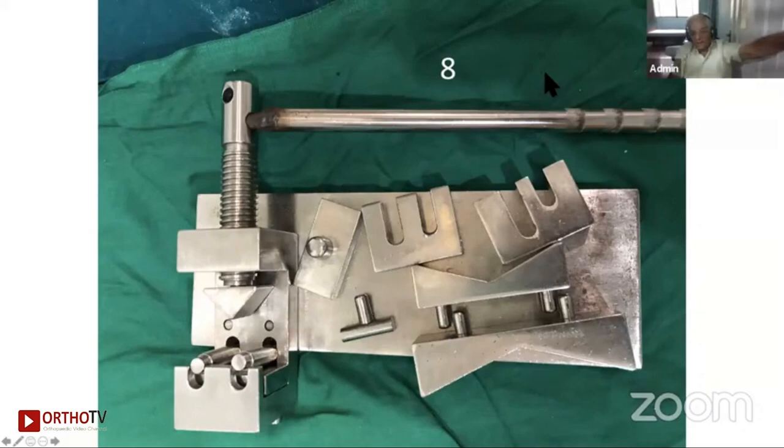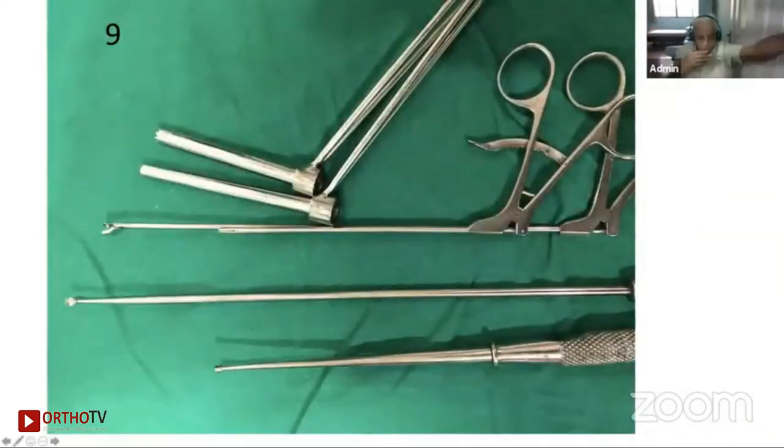Yes. Now here is this instrument set. I purchased it from one of the instrument companies, for the abdomen, for the stones, and all these are the small instruments which are available. You can see these big tubes and all. I have not manufactured them specially for this. I went to one of those companies which used to send scopy instruments, and I purchased them, and they can be very useful for percutaneous biopsy.